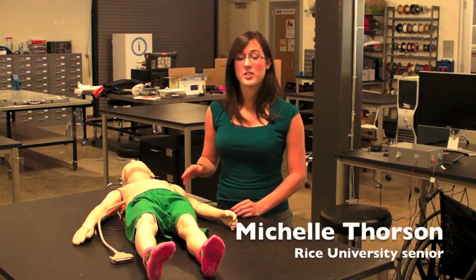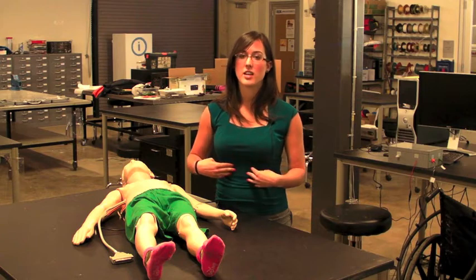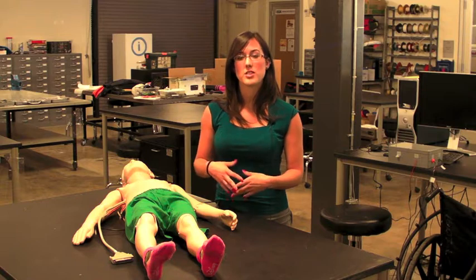This is a mannequin for the physical exam. It teaches the skill of palpation, which is when the doctor uses his hands to feel the size, shape, location, and feel of different objects in the body.